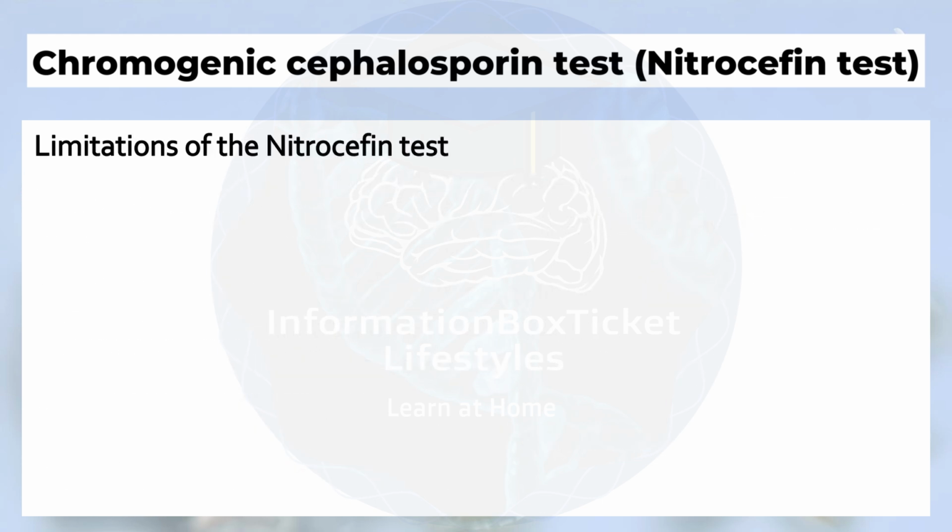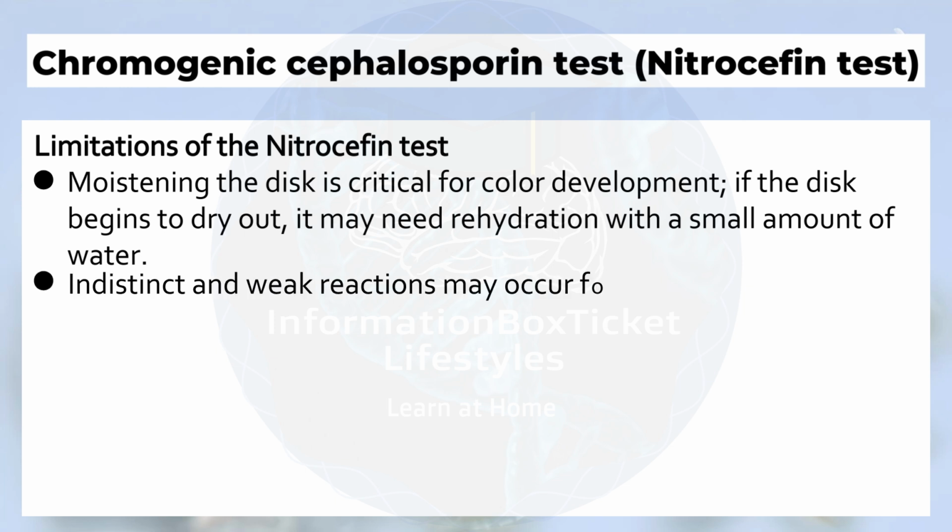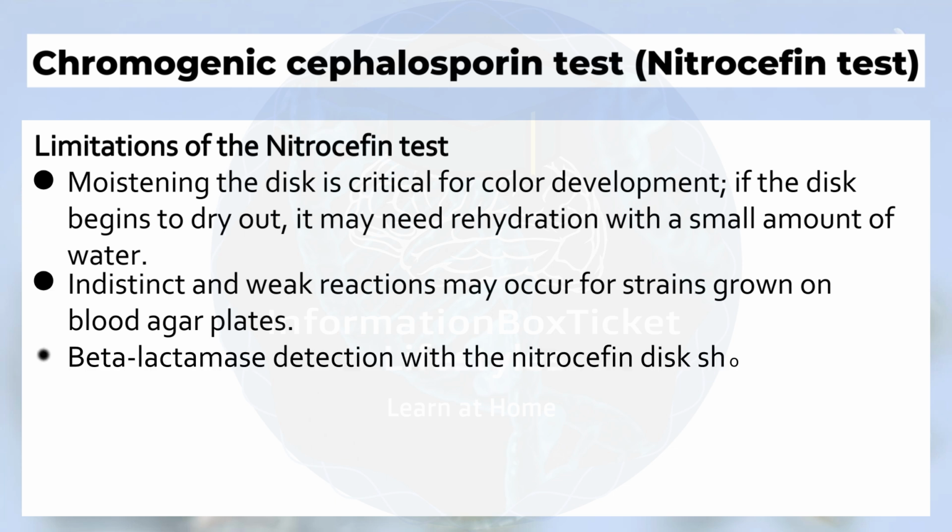Limitations of the Nitrocefin test. Moistening the disc is critical for color development. If the disc begins to dry out, it may need rehydration with a small amount of water. Indistinct and weak reactions may occur for strains grown on blood agar plates.